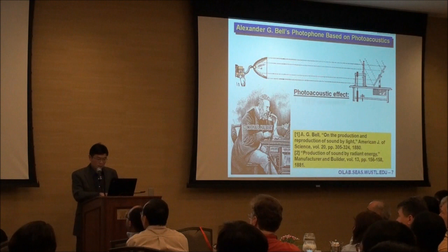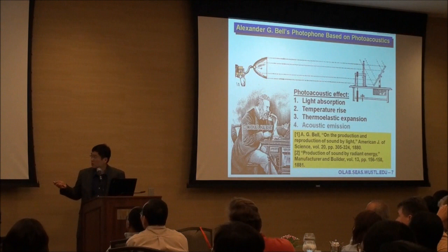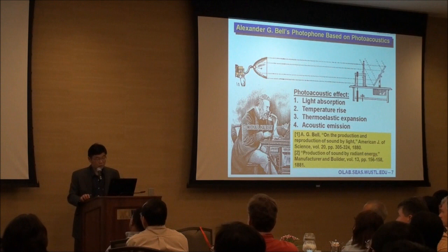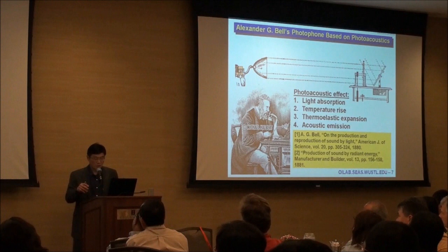Where light is first absorbed, inducing a temperature rise, due to the thermoelastic expansion, you would generate an acoustic emission. Of course, today we're interested in the ultrasound frequency range because we want to shorten the wavelength for better spatial resolution. Now, Bell never used photoacoustics for imaging purposes. Tomography was not even in the lexicon over 100 years ago. So this is a very new concept in terms of 3D imaging. So we're using somewhat old physics in a very new imaging method.